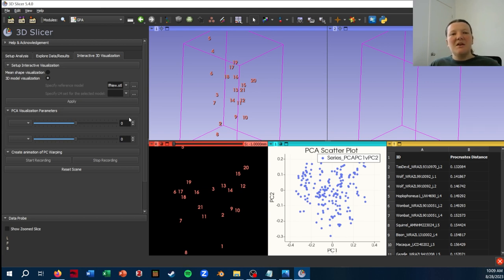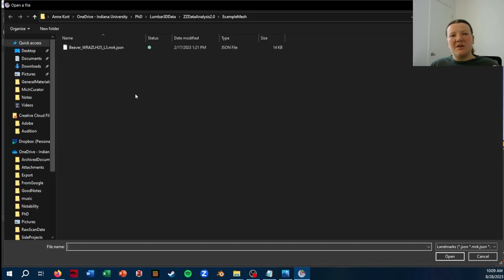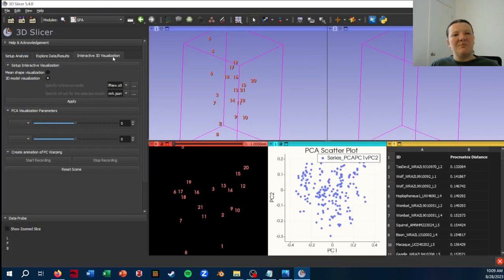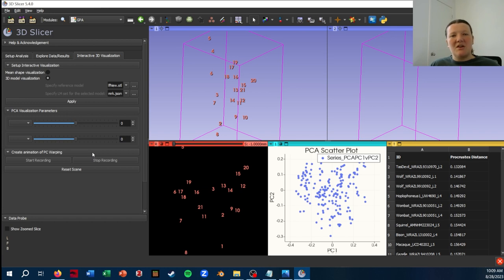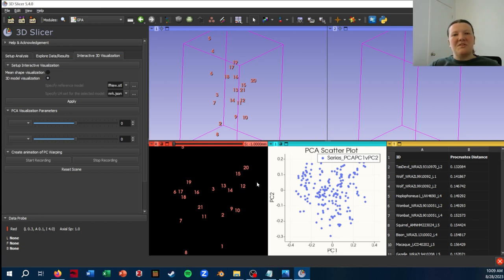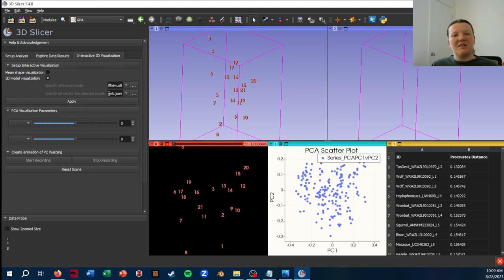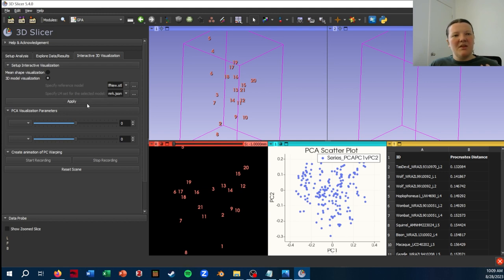Next SlicerMorph needs the landmark set for this vertebrae. I have that kind of separated out just to make my life a little bit easier right here. So you have to make sure these match. You will get really funky errors if either the landmark set is off or your model is off for whatever reason. For instance, if it's been mirrored, I've done that a lot since I did a fair amount of mirroring and putting this data set together. But once you've selected your landmark set and your model, you can click Apply.